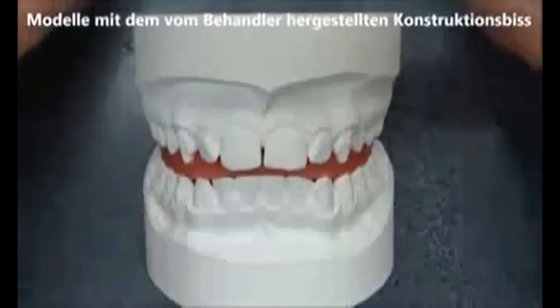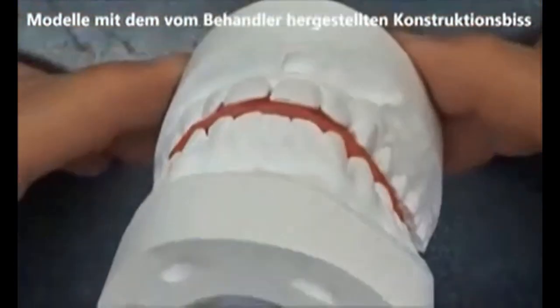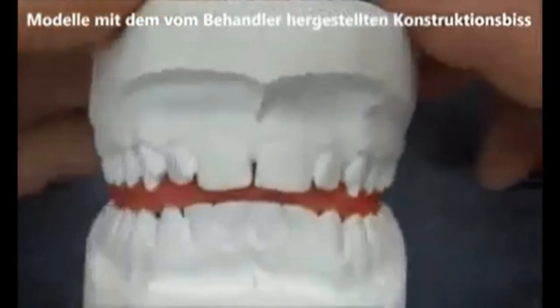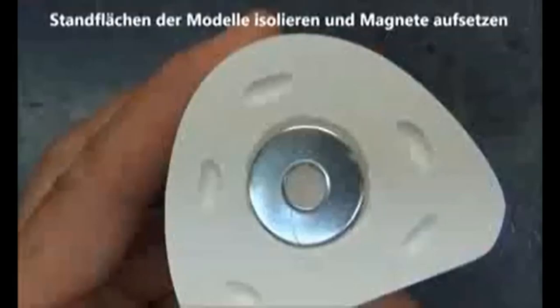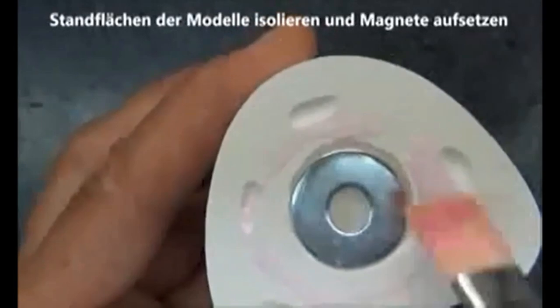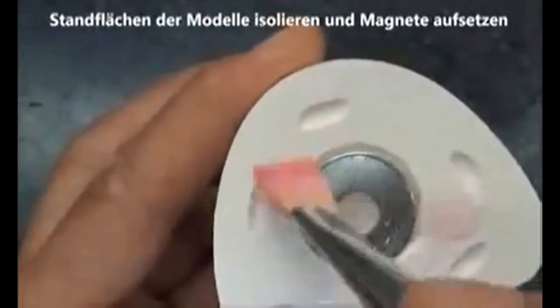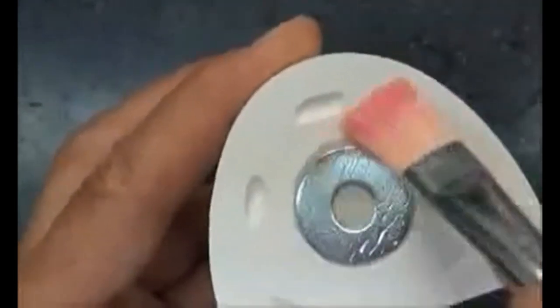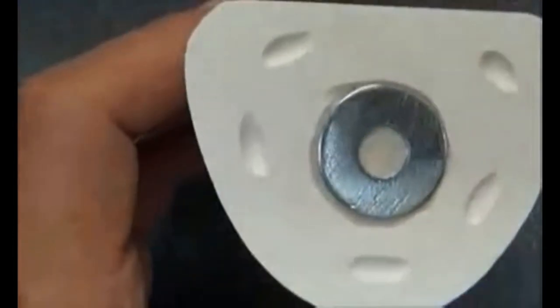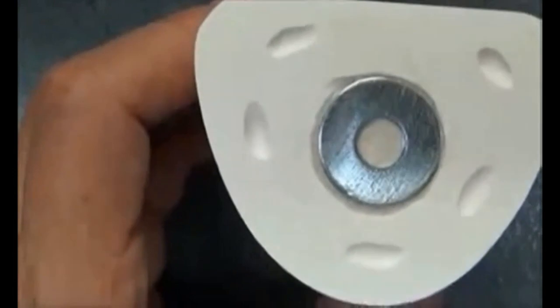So we actually do it on the patient directly, but this one is we recorded the construction bite. We made the patient bite in a forward position with class 1 molar relationship and almost class 1 edge to edge incisor relationship, and we articulate in this position now, and we are going to make the appliance in this position itself. So we are going to force the patient to bite in this forward position always, and hence make the mandible grow in a forward position.